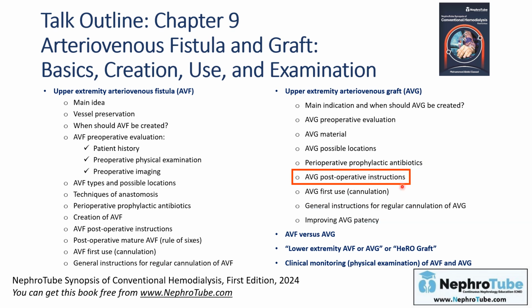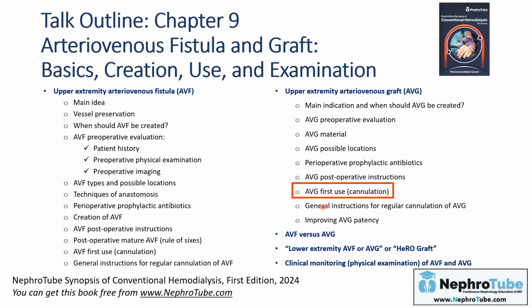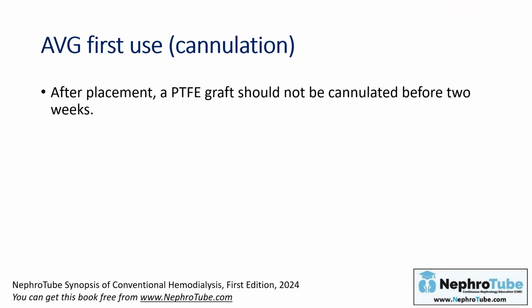Regarding post-operative instructions in the graft, they are the same as we mentioned in the fistula, except that there is no any rule for exercise at all for AV graft maturation. Regarding first cannulation of the AV graft, we discussed before AVF first cannulation. Regarding the AV graft first cannulation, it is the same as AV fistula, but there are some points that are unique for the AV graft.